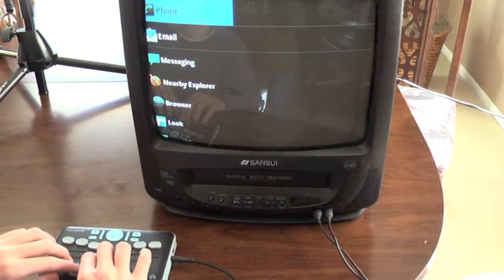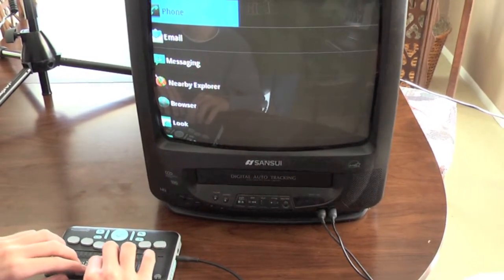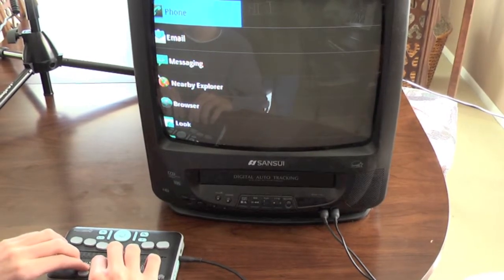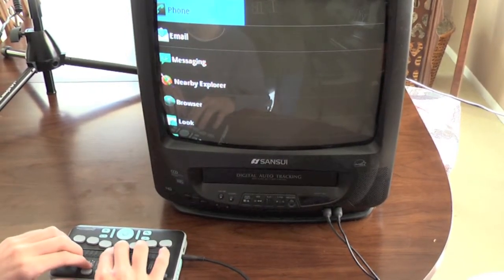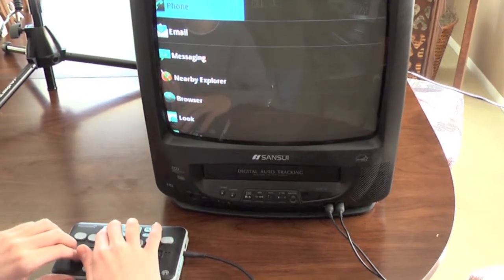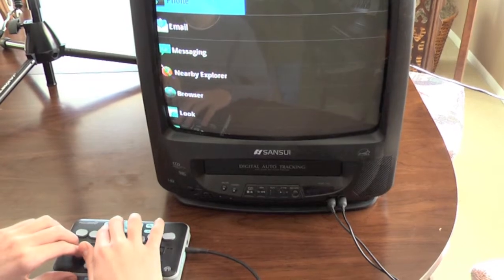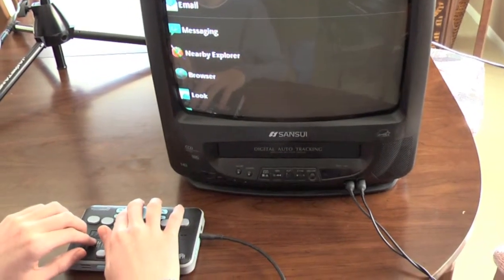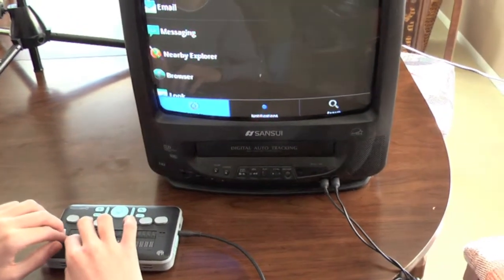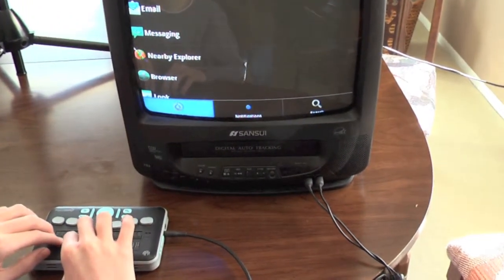So the home screen is a very simple screen that you navigate, again, just with your up and down arrows that will allow you to easily open any of the applications that you wish to use on your Braille Plus 18. Now, if we press the menu key, which is the button located directly to the left of the arrow keys, this is a long vertical bar, Menu, settings, 1 of 3. We are placed into a menu.